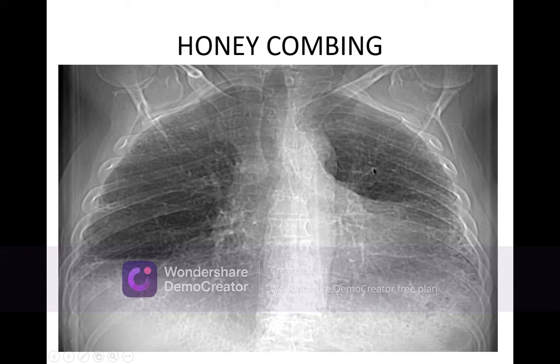Look, the reticulations, nodulation, reticulation spaces, just like holes. You see here, holes. Now, this is called honeycombing, which can occur in many conditions. In honeycombing, for example, tuberculosis can cause it. As far as acute inflammation and chronic inflammation are concerned, tuberculosis can cause localized honeycombing, and fungal infection can cause honeycombing.